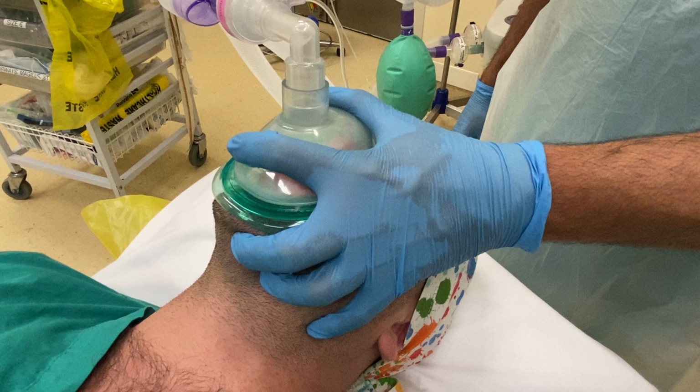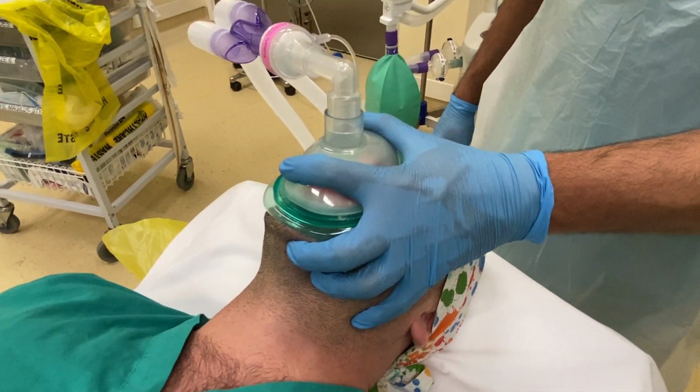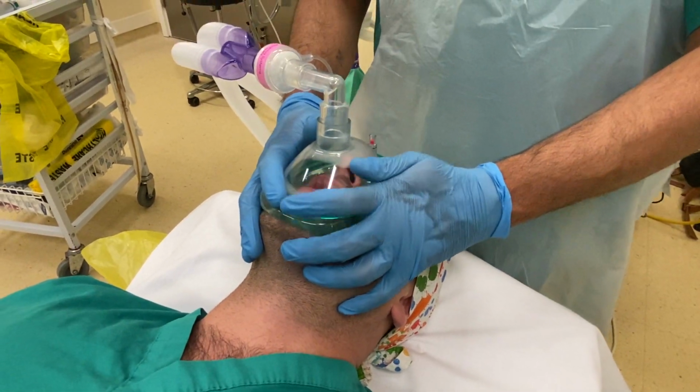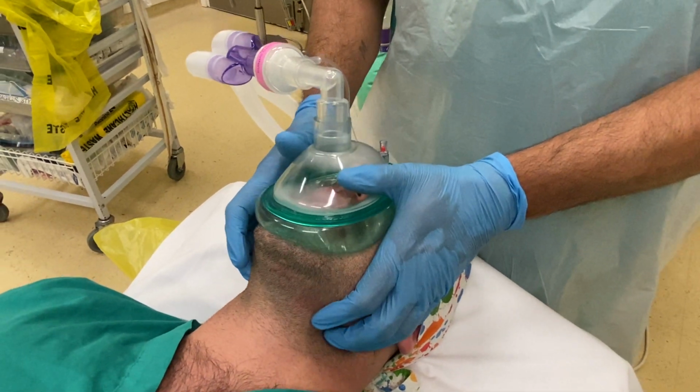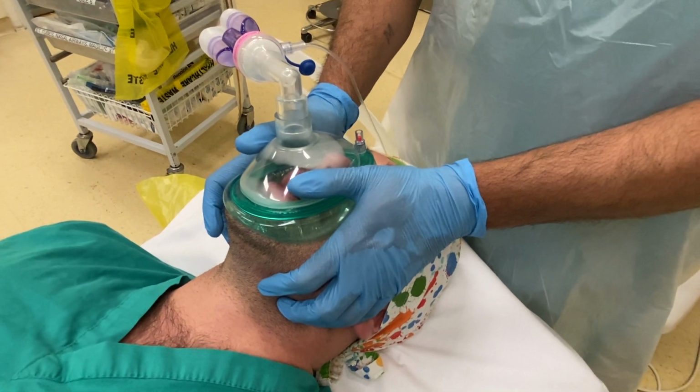When you're starting out, this can be difficult, so you do it with both hands. So Kumar is going to show you a CE grip with both hands here. We do it with one hand because we're practiced, and we use our second hand to bag the patient, squeezing the bag. Now, this is the final way to hold a face mask that Kumar is going to show you.